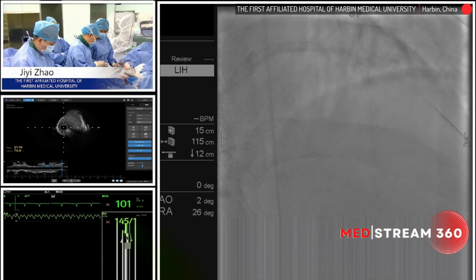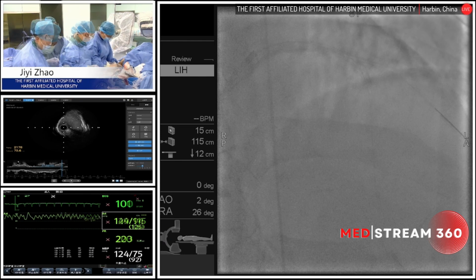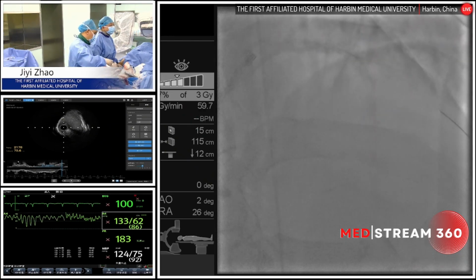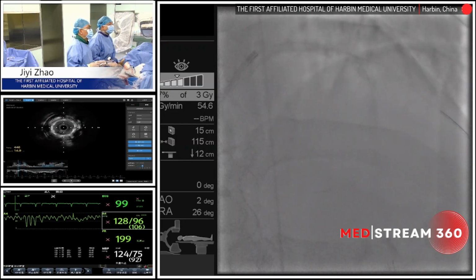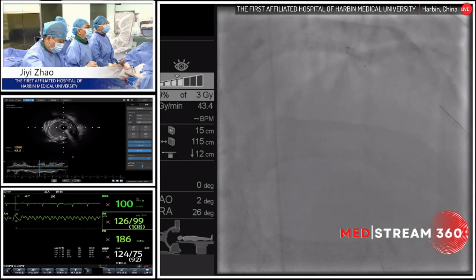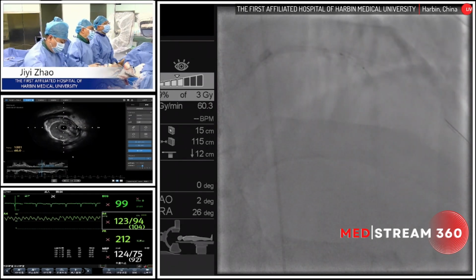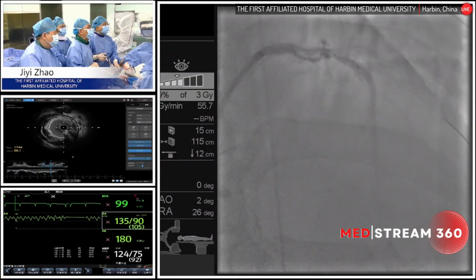And today we are using the 100% domestic software made by a Beijing company. It's called Insight Lifetech. We can see very clear and also very sharp borders of the vessel lumen, and also we can see the stent struts very clearly. Okay, we make some good NC balloon post-dilation for the first stent, and then later we are going to put the second stent in.